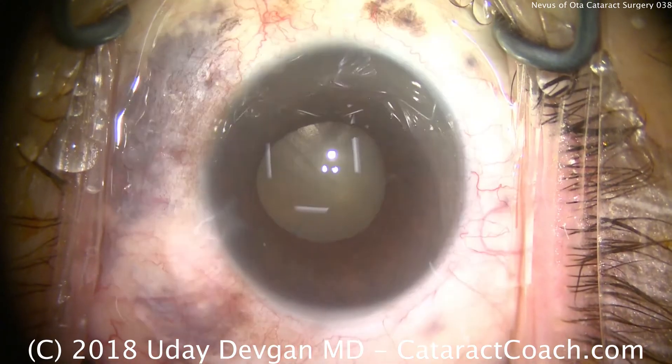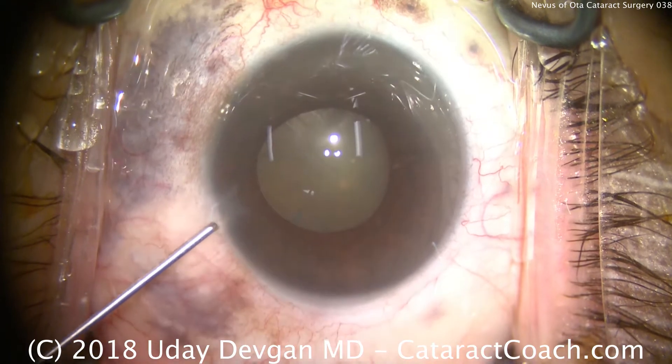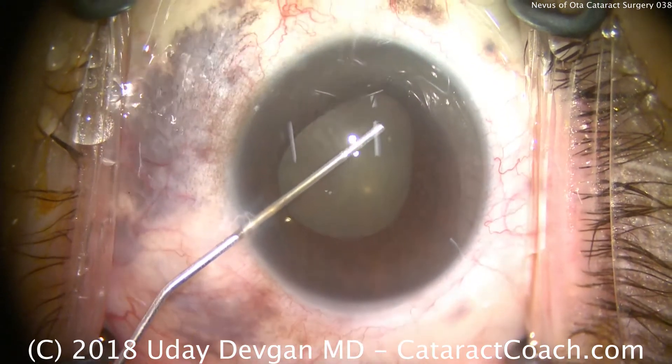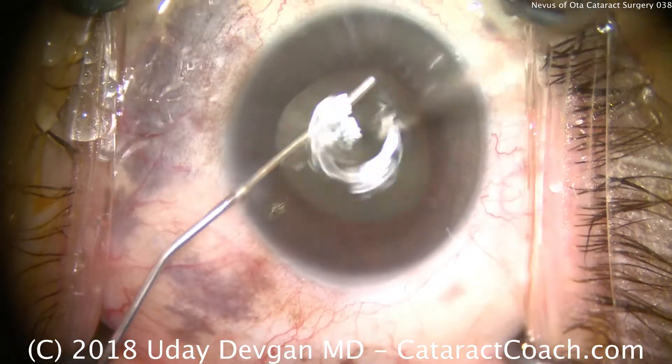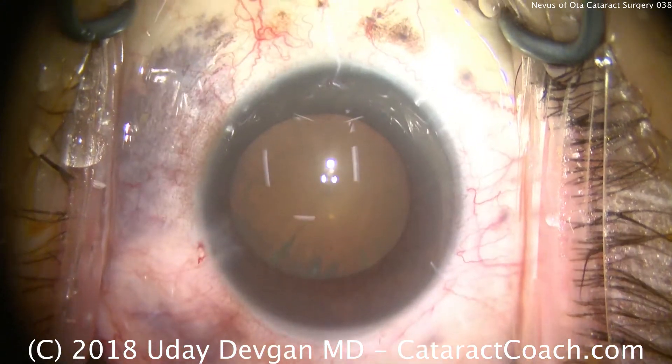After instilling that agent, it did make a big difference. We'll now use a dispersive viscoelastic to perform viscomydriasis — injecting in all areas to use the viscoelastic to open the pupil and give us mydriasis. That looks much better now.